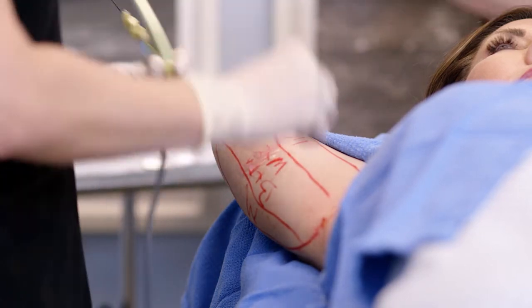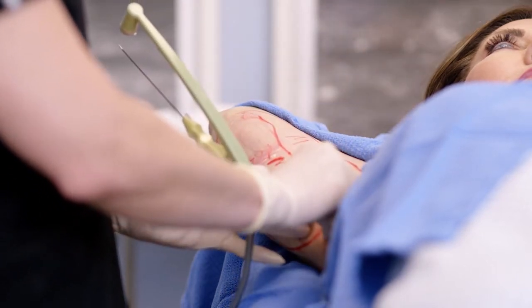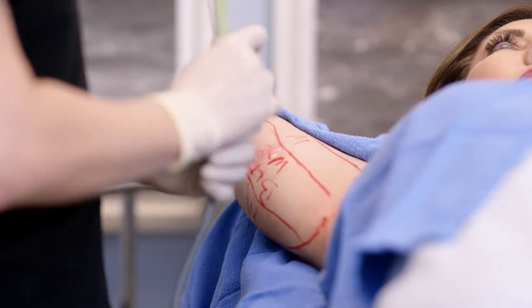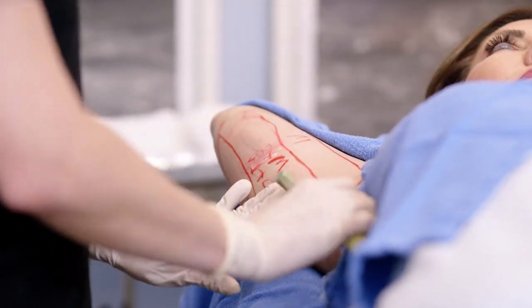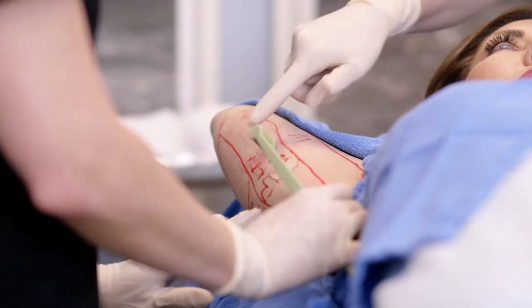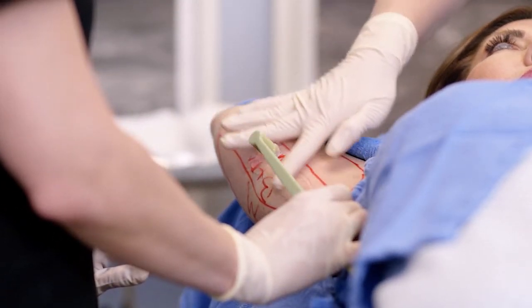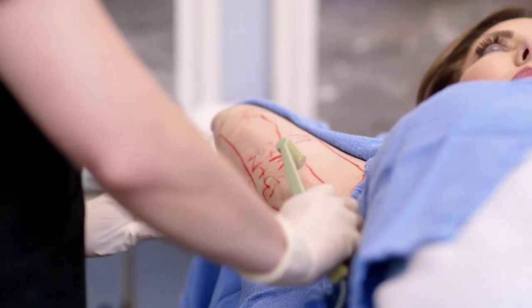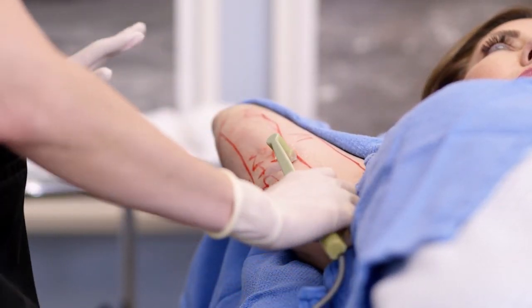I just use a little needle to make just a little poke so that we can easily insert this little cannula. It goes right underneath the skin. And lots of gel just to make sure that energy transfers well and doesn't cause too much heating of the surface of the skin. And then we go again.